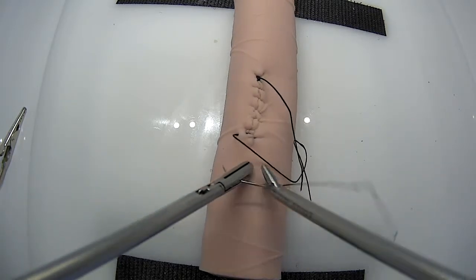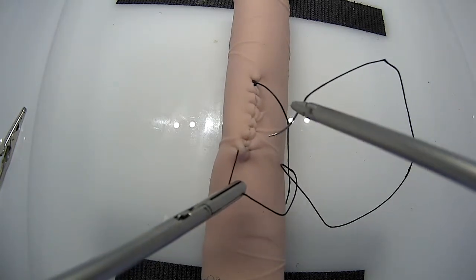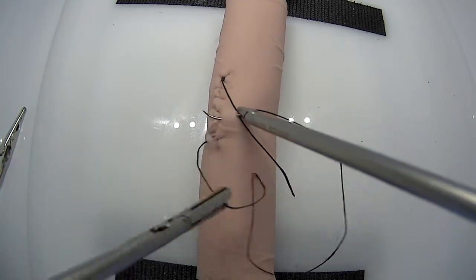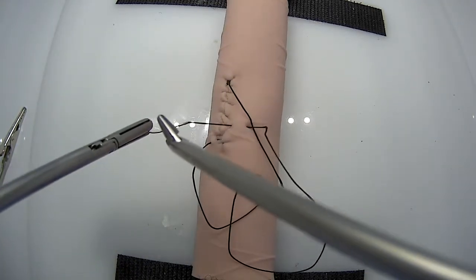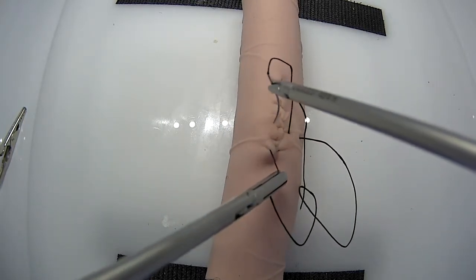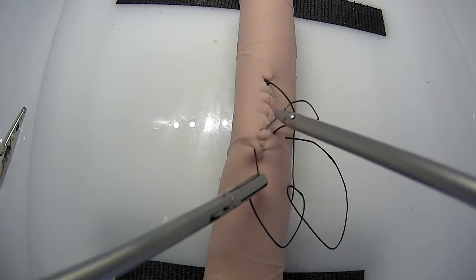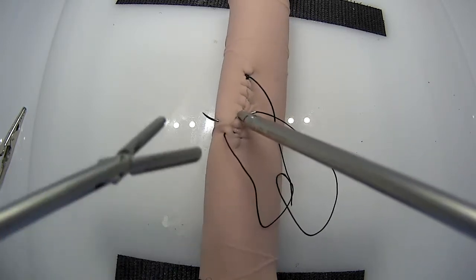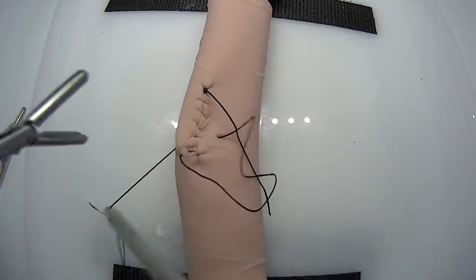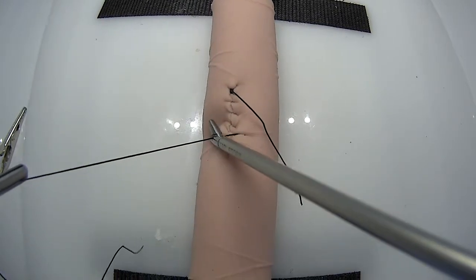When you take these Lamberts, it's very helpful to follow yourself. This allows you to keep the tension on the suture line, but also allows you to move the bowel onto your needle. It allows you to manipulate the bowel without having to grab the bowel. You can take precise bites. You want to cinch.